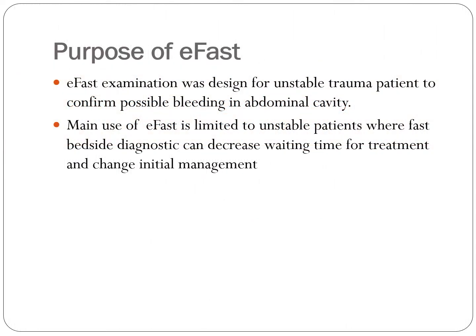So what was the initial purpose of FAST? The FAST examination was designed for the unstable traumatic patient to confirm possible bleeding into the abdominal cavity. However, the more we know about FAST, the more we know that we can use it not only in traumatic settings, but in all clinical settings when we have an unstable patient and we think that they may bleed into the abdominal cavity or may have free fluid in the abdominal cavity or pleural cavities.